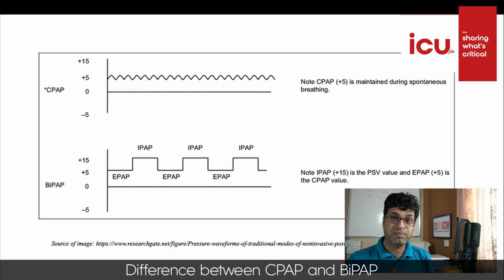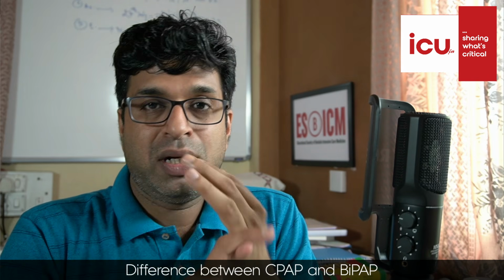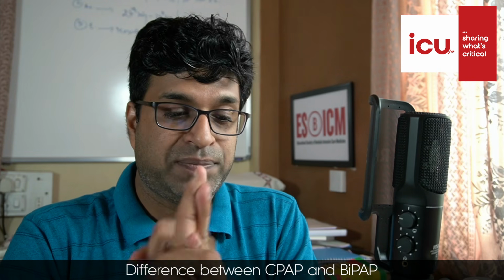And your IPAP is basically pressure support above PEEP. You have understood that there is a mode called pressure support above PEEP ventilation. So IPAP is pressure support above PEEP, then exhalation, and this PEEP or EPAP remains continuous throughout the cycle. What this helps is, it helps to maintain oxygenation and helps to maintain the PCO2 level also. Now the important point is, it is not that EPAP is for your oxygenation and IPAP is for ventilation. It is the difference between these two values which is important.